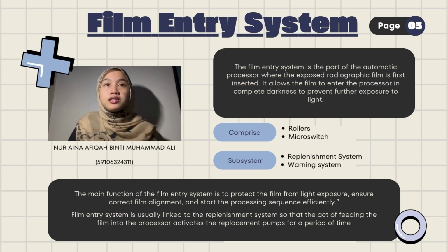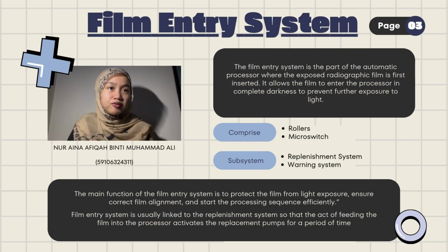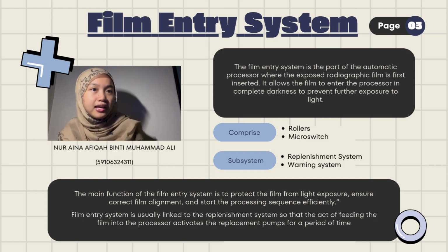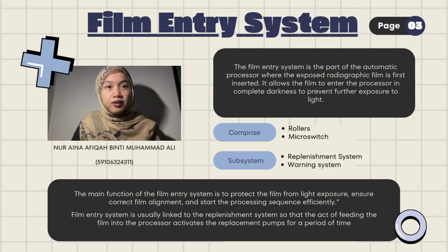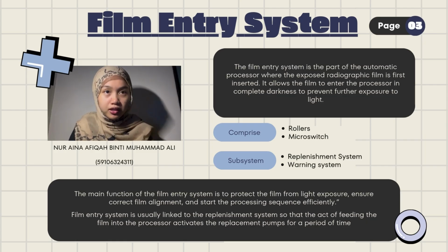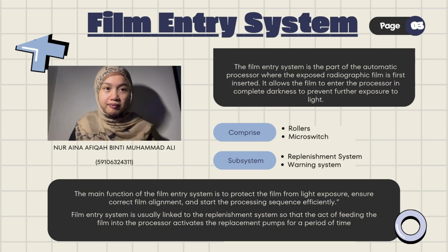The main function of the film entry system is to protect the film from light exposure, to ensure correct film alignment, and to start the processing sequence efficiently. The film entry system is usually linked to the replenishment system so that the act of feeding the film into the processor activates the replenishment pumps for a period of time.